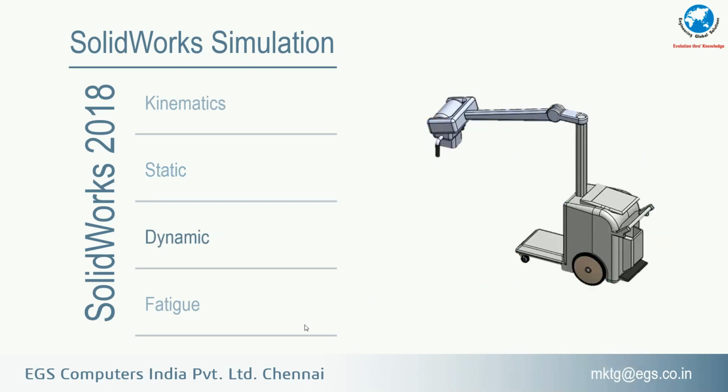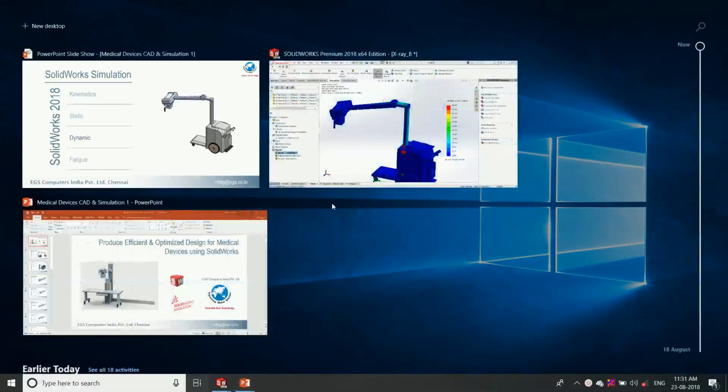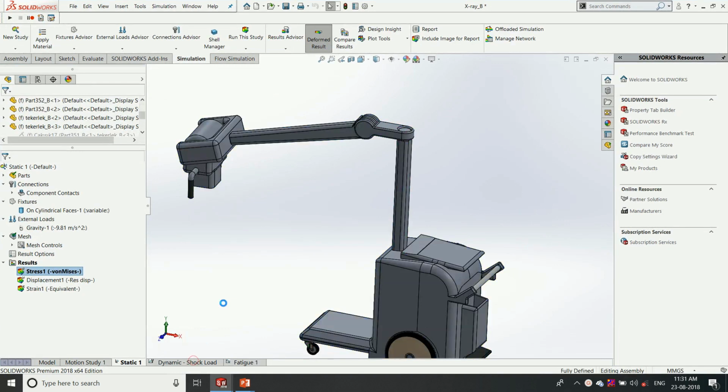So in dynamic analysis, we will see whether the structure withstands dynamic loads, because in real-time conditions an unexpected load may act on the structure and it should not fail. In a hospital, where patients are involved, it should be safer than in predictable conditions. So in the dynamic study, we are going to study whether the structure can withstand more stresses and more load in different directions other than the operating conditions.